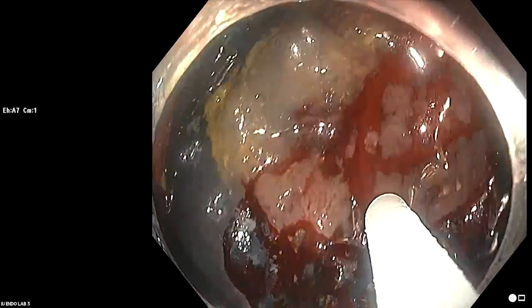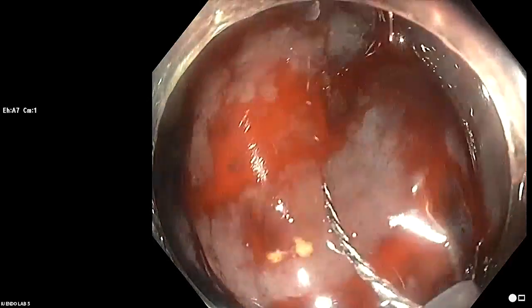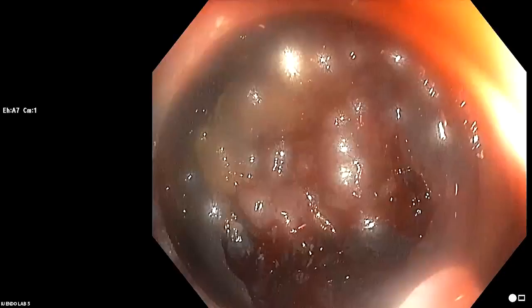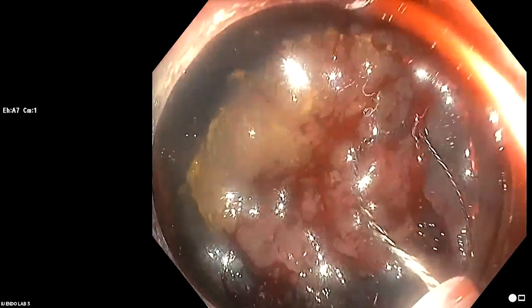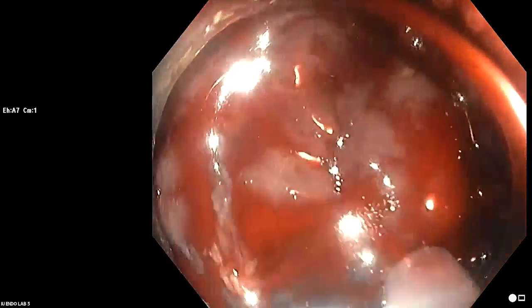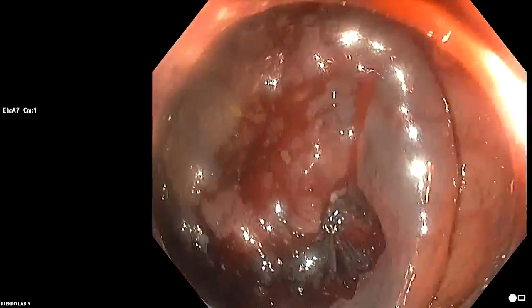It didn't reduce the risk of delayed hemorrhage when serrated lesions were removed hot. All the benefit was for adenomas. And so maybe even if you remove it with electric cautery, right now the evidence is you don't need to clip it if it was serrated.